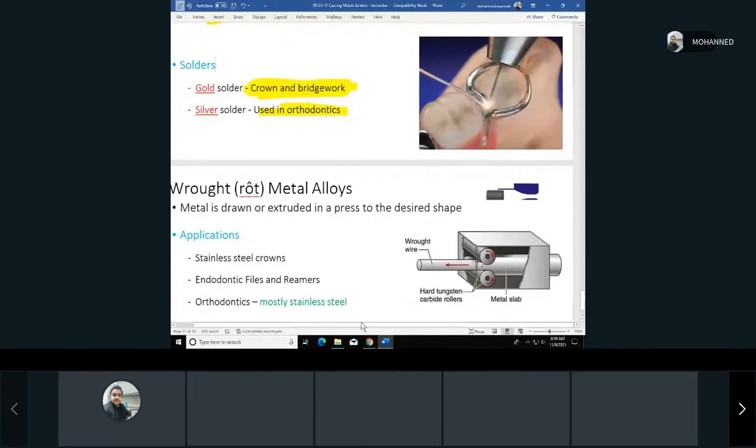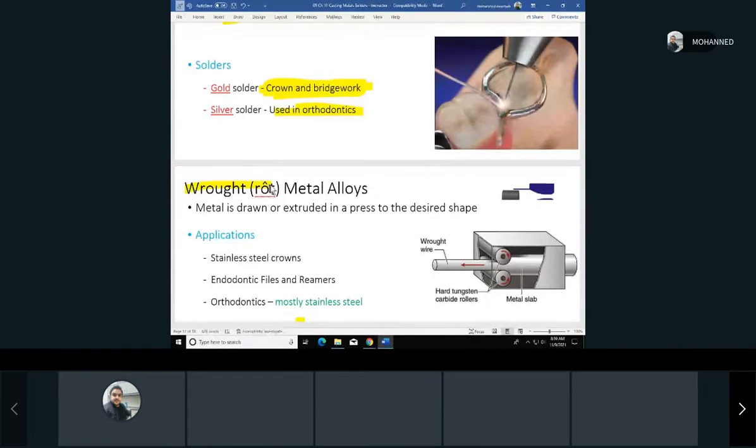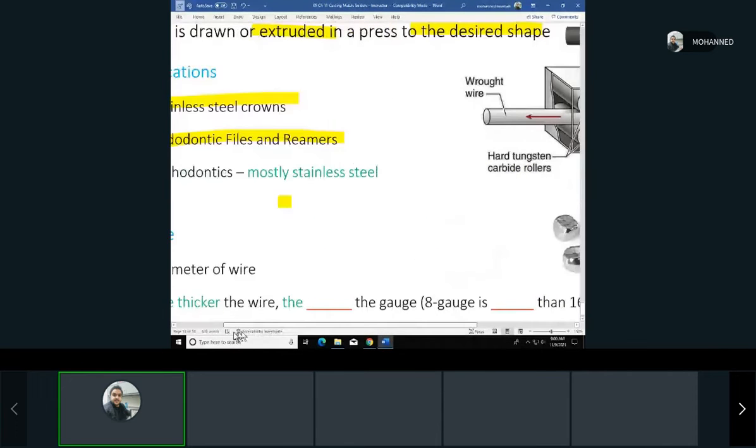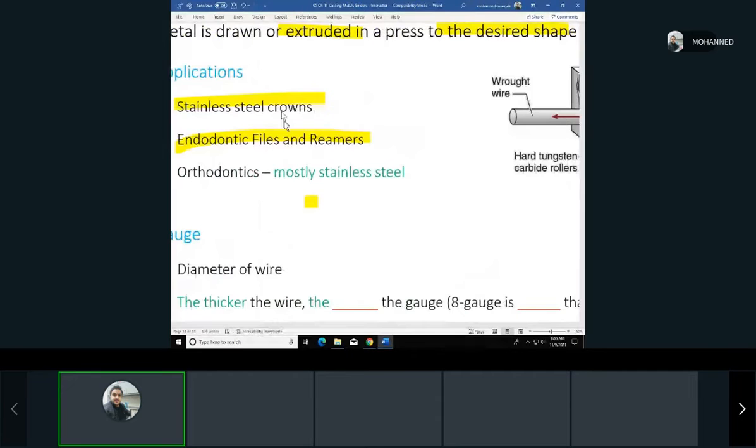So let's see here. And the last are wrought metal alloys. These are the ones that are extruded or pressed to the desired shape. This was an animated picture, but it doesn't show here because we're not on PowerPoint. But anyway, you put the metal through something that will press it, and you can make the gauge smaller as it goes out. Applications are for crowns, for endodontic files and reamers, and orthodontics, where it's mainly stainless steel. This is to make the stainless steel wires that we use in orthodontics.